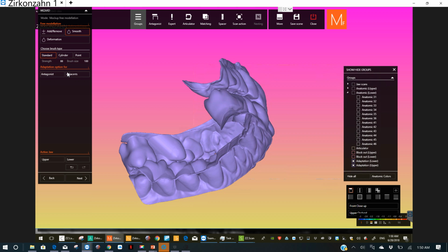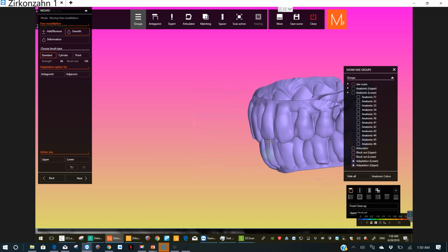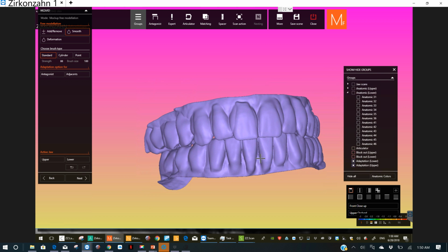And probably we want to thicken this area up so they can wear these before. If they're kind of big and bulky, that's a good thing, because then when they get their real bridge, they're going to love it compared to this. So let's go show how we make this.